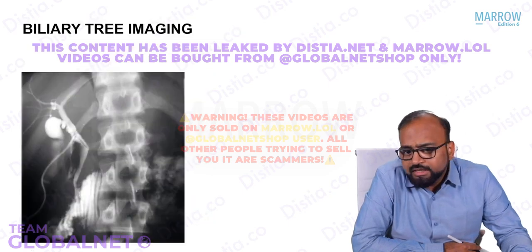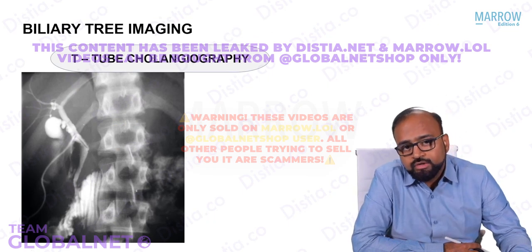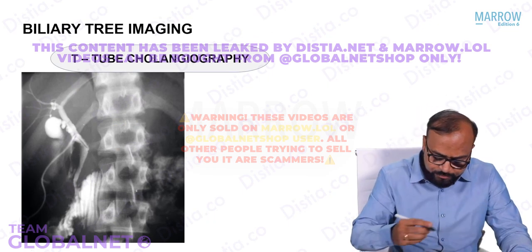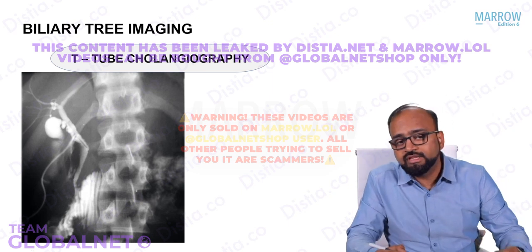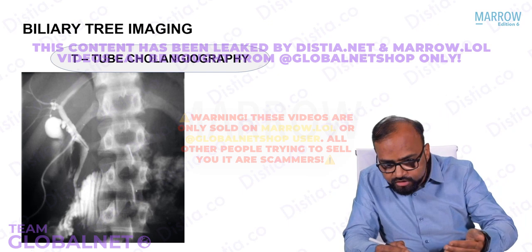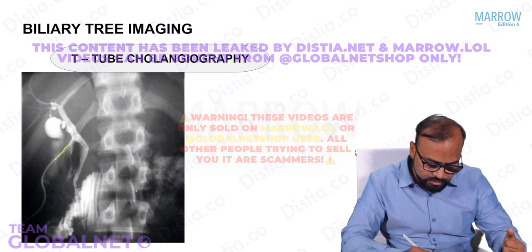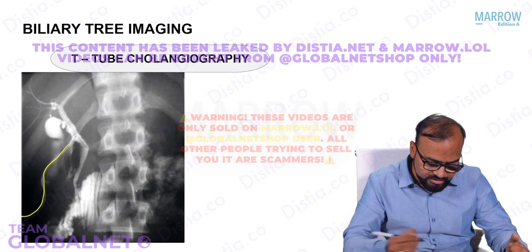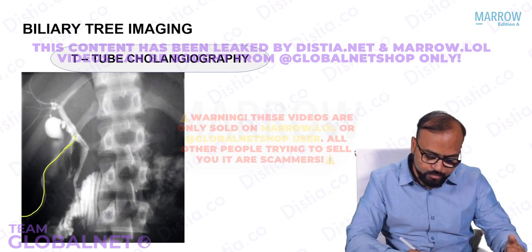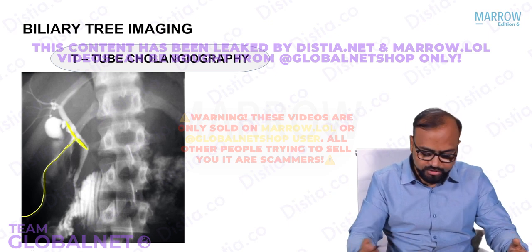Yes. Now for biliary tree imaging, another technique can be used. This is called T-tube cholangiography. What is T-tube cholangiography? See, this is usually done when the biliary tree has been operated upon. Say, for example, there was a biliary injury which was repaired, or an anastomosis which was done. So with a T-tube, the stem of the T is outside, right? One limb of the T goes into the proximal biliary tree. The other end goes into the distal biliary tree.